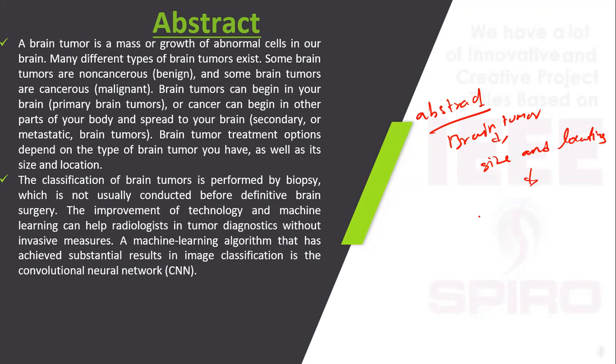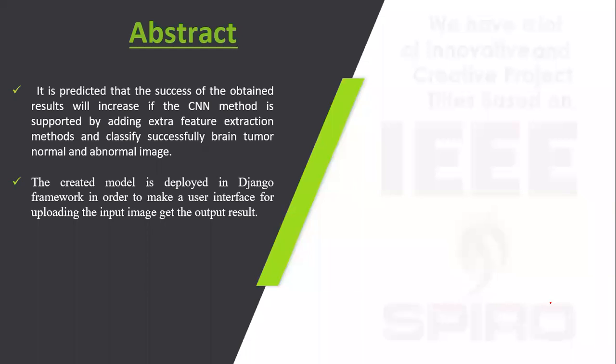In our project, we take a brain tumor dataset and train a deep learning model using CNN. After training the deep learning model, we deploy it with the Django web framework. And here we use the SQLite 3 database.